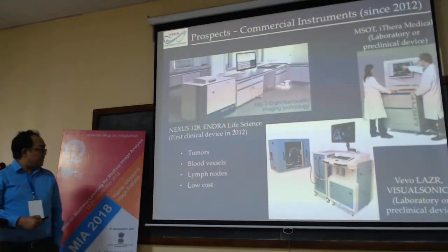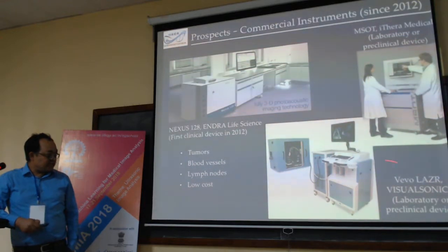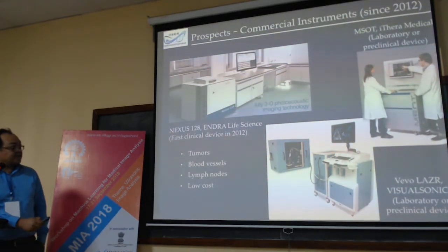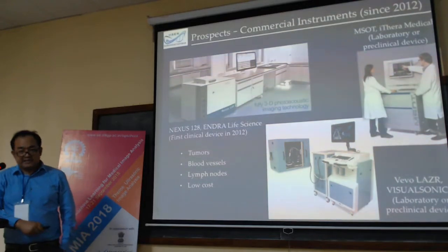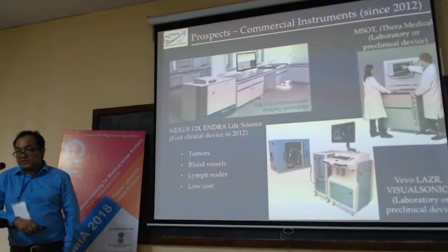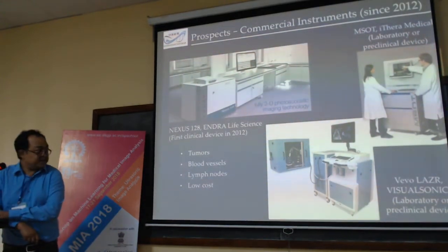So iThera Medical for this kind of application, and VisualSonics for dual imaging of ultrasound and photoacoustic, and then one more. This one is German-based and this one is Netherlands-based. That one I'm not sure. I think very recently one Chinese company also came up with low-budget imaging systems. That is in the market. Okay.